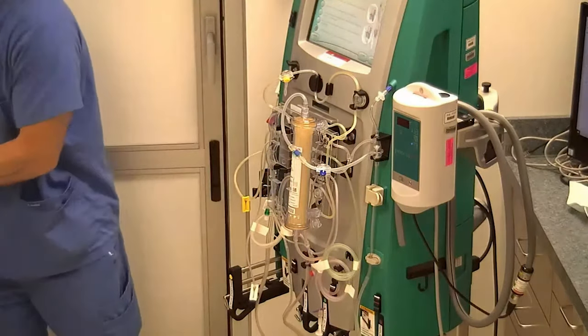You don't have to stand here and watch your machine prime. The machine will not beep or alarm at you. Actually, it says the next intervention is in 5 minutes. This priming bag will be empty when you come back, and it'll have a little screen showing the spike, our second bag of saline. So from here, you can go off and do whatever you need to do for your patient.